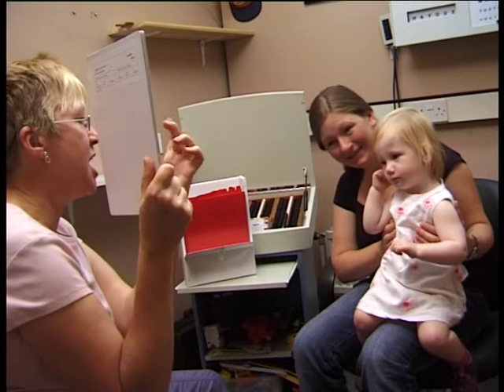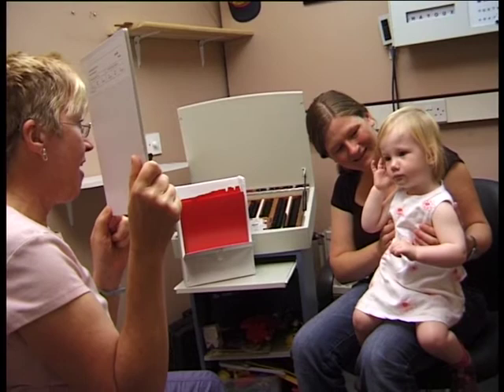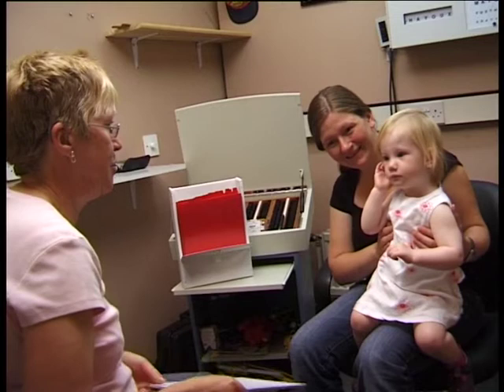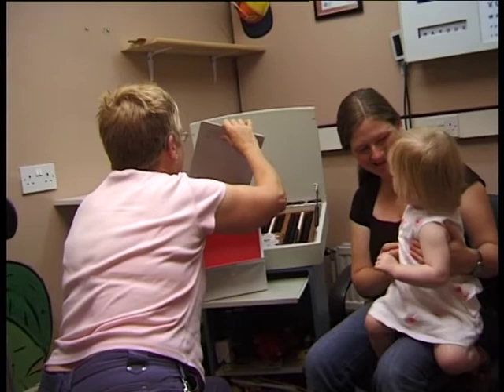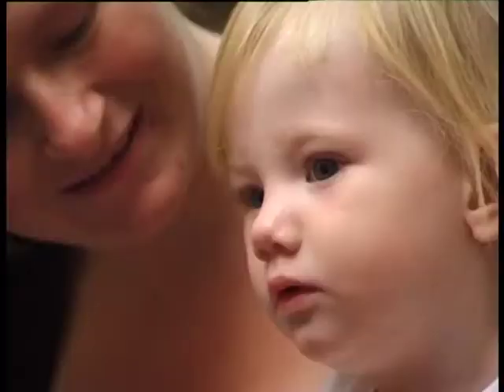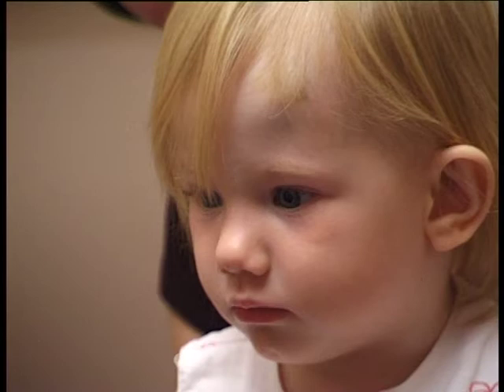We carry on through the sequence of cards until we're no longer able to judge where the picture is. Watch Arwen's eye movements now — at this stage it's not possible to tell where the picture is, simply because she's not looking reliably in either direction. We can go back and show Arwen an easier picture. The end point of the test is the finest visual acuity card for which we can reliably judge the position of the picture.